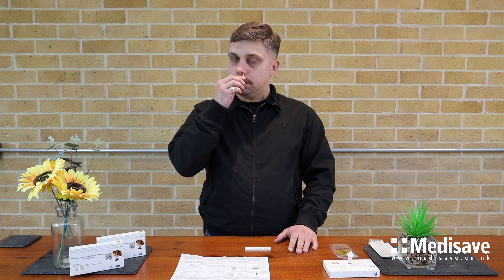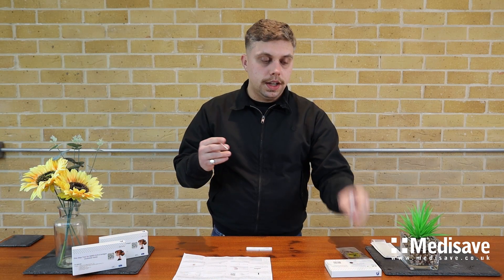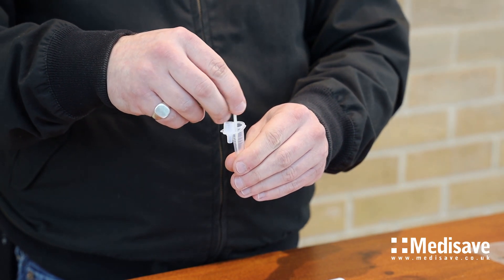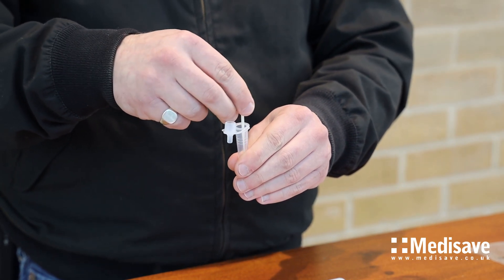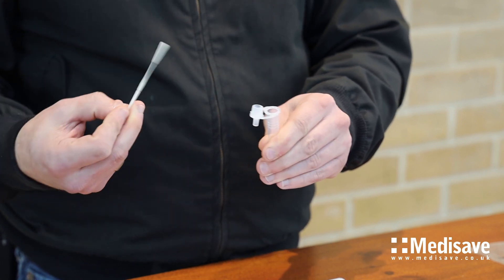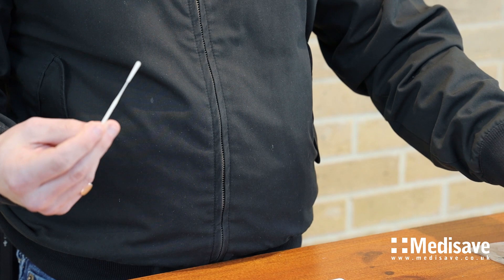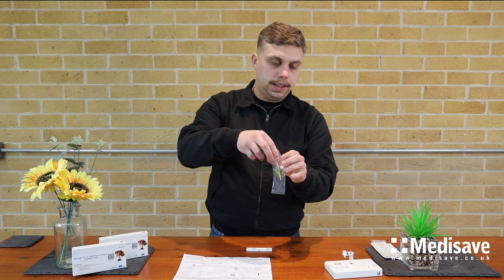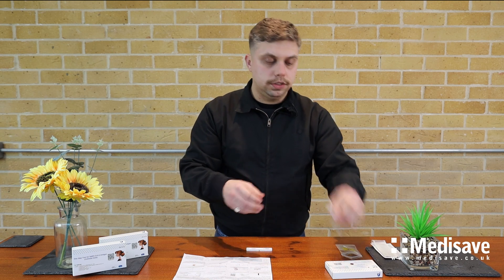Gently insert the swab no more than 1.5 centimetres, turning four times in each nostril. Then take your extraction tube, insert the swab into the extraction tube, spin four times and gently squeeze the edge of the extraction tube removing the sample, and place the extraction tube back in the holder and the swab into the bag, and close the lid.